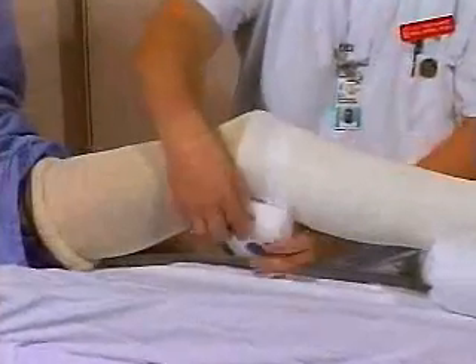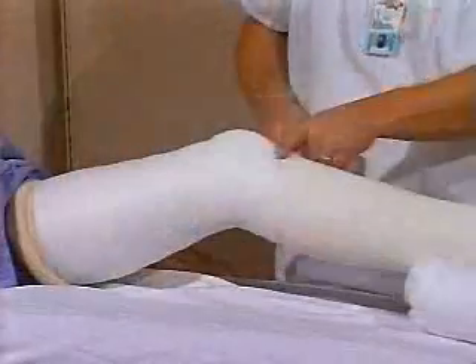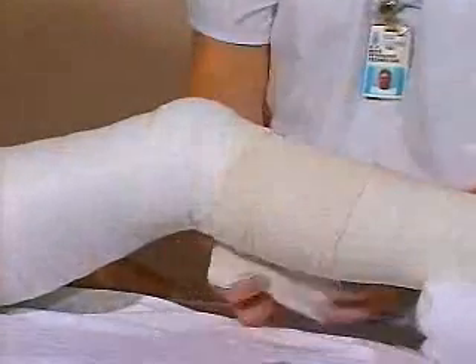For the upper half of the cast, start the padding over the head of the fibula and extend proximally with four to five layers thickness at the upper thigh. Overlap the old plaster by the width of a roll with the new plaster and extend proximally.